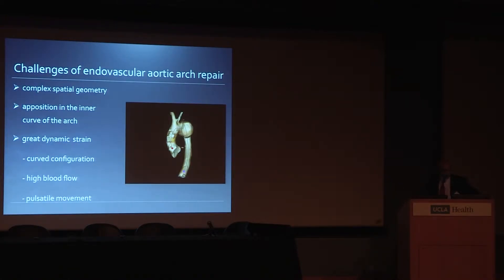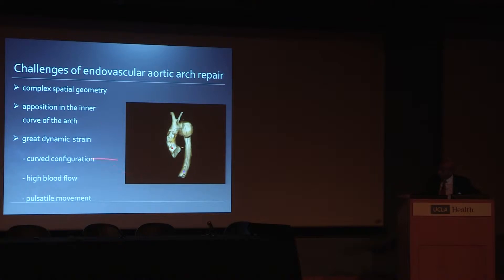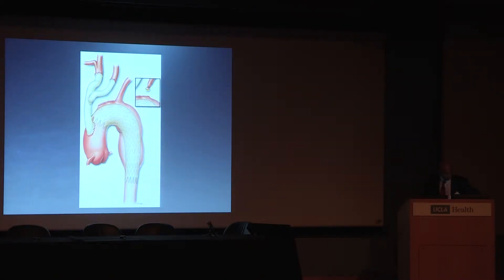What are the challenges of aortic endovascular arch repair? Obviously the geometry is complex. When we first started doing this, we knew we were going to have problems with apposition of the inner curve of the arch with the endovascular stent graft. The big question is what's going to happen long-term with the high blood flow, high pulsatility, and the great dynamic strain in the proximal arch.